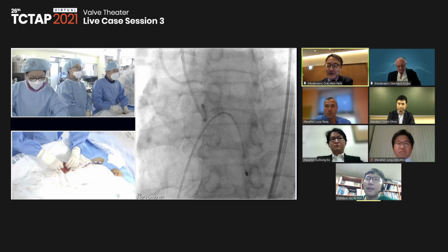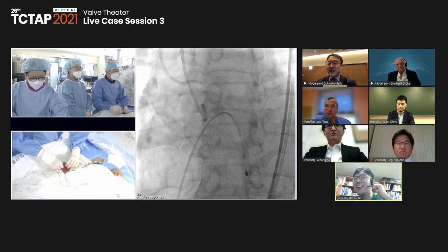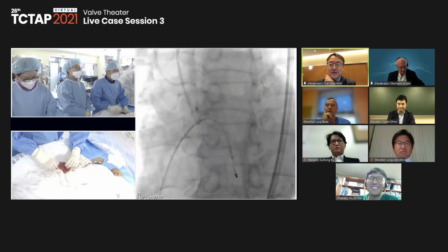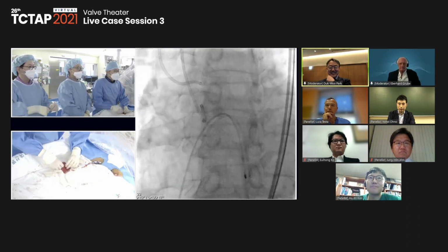Okay. Also, can I ask one question to all the panelists? Professor Kim, how about the ending of this procedure? We have just 4 minutes remaining, and then we will have another discussion time. We will see how the cardiac surgeon does the TAVR procedure. That's stiffer. That can make a more straightforward direction.